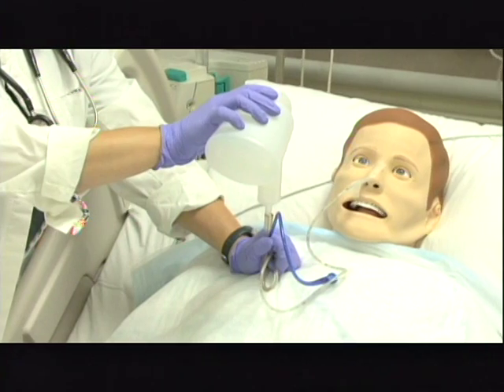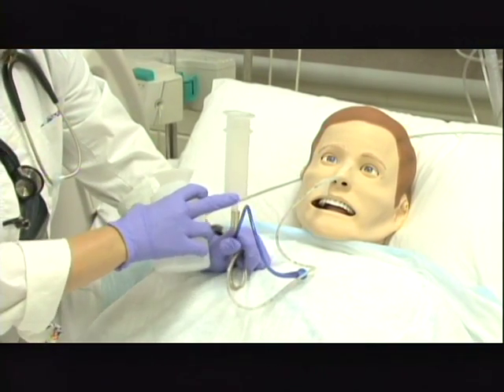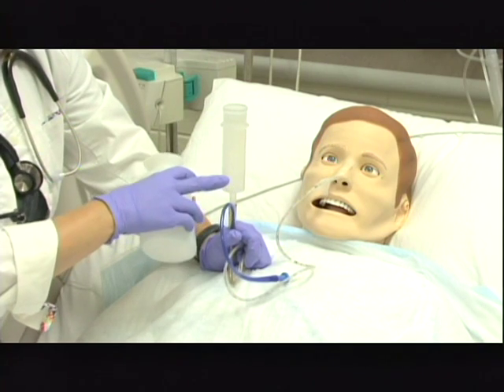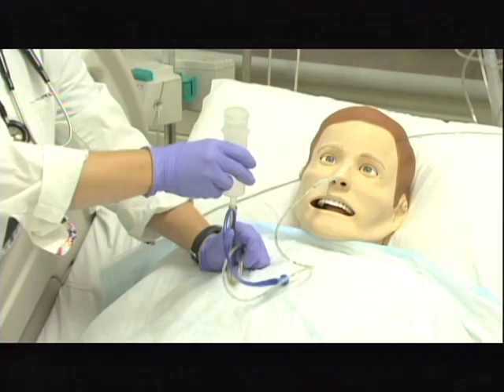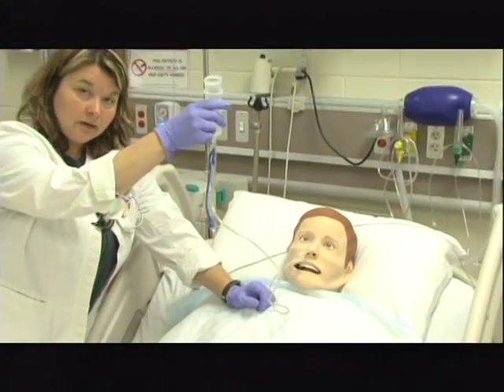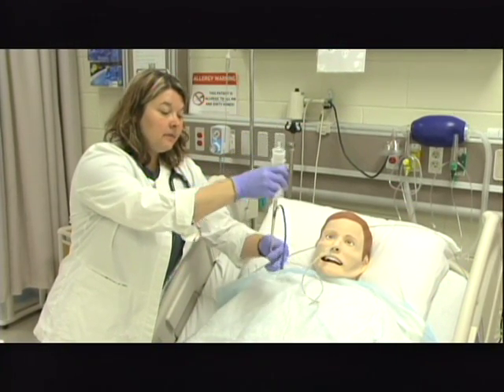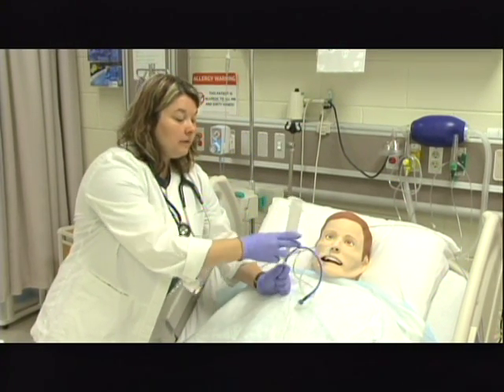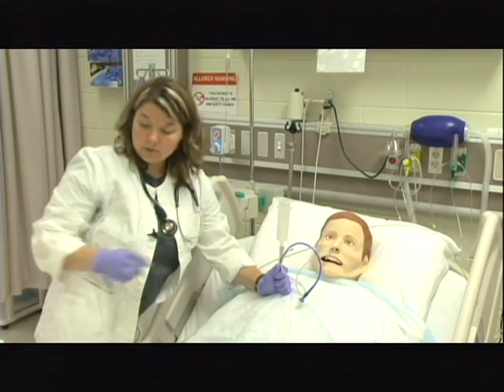So I would put whatever the prescribed irrigant is. I'm going to put about 10 milliliters here, and I would watch the level of the liquid. And then when I'm ready for it to infuse, I'm going to unclamp, and gravity is what helps this infuse. So the higher you hold it, the quicker it's probably going to go. I now need to clamp the tubing back before the liquid runs out of the syringe. I have now pre-irrigated the tube.